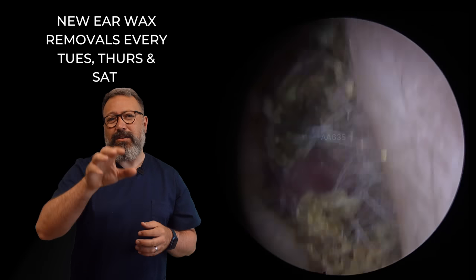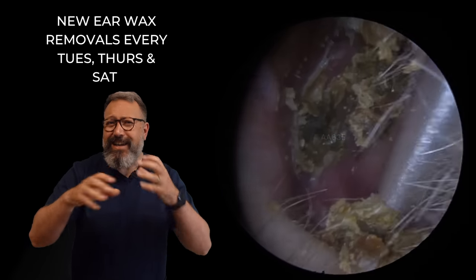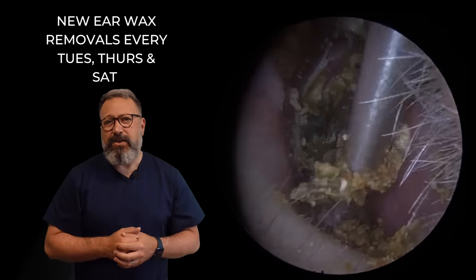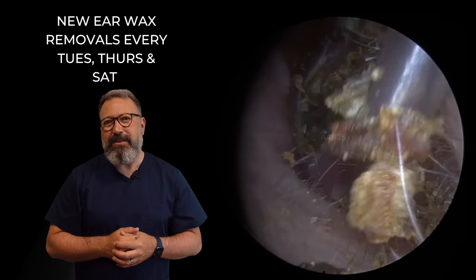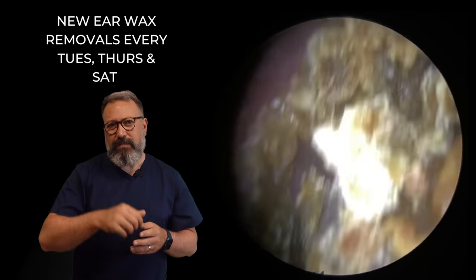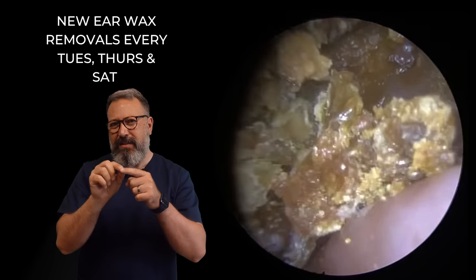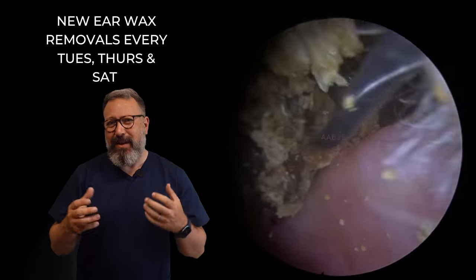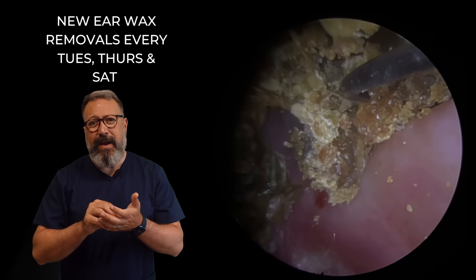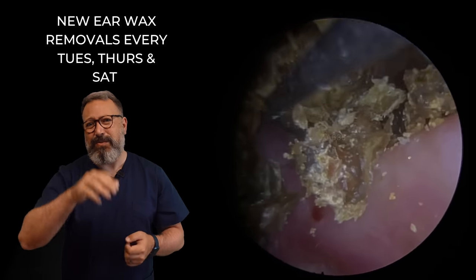Out that comes. Let's take a look behind — we've got a lot of loose debris here at the bottom of the canal, so let's start using a little bit of suction to tidy everything up. You can see all these tiny flakes just blocking the suction too. We've got more skin and wax everywhere on the top. You might have spotted just a little tiny bit of bleeding in there — with this type of wax that's not uncommon. As you're pulling this off the ear canal wall, a little bit of dry skin is obviously going to be embedded in there, and when you pull it, you might get a little tiny bit of blood appearing.